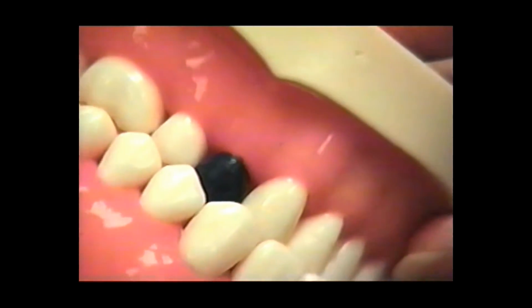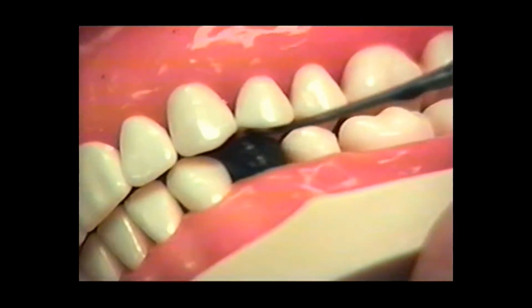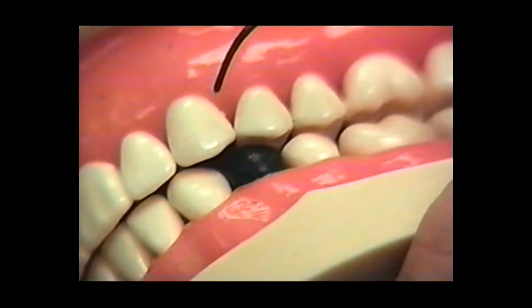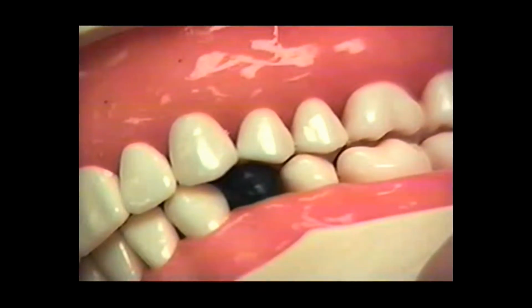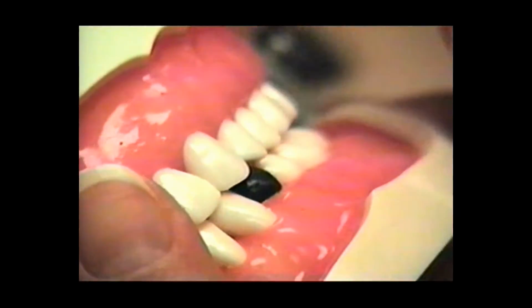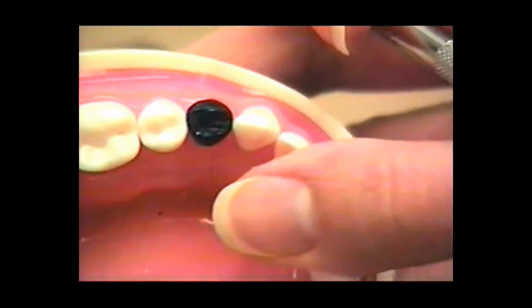Okay? So now what I've done is I've looked at where my cusp tip was as I developed those embrasures and facial contours, and I made sure that it was pretty close to where I need it to be. And if you look, your cusp tips are all in a row, and they're all coming in and meeting the maxillary teeth pretty much at the same spot. And so that's where you want to aim your waxing. And you'll notice that not once have I looked at the contralateral tooth as a guide. I didn't need to, because I've got all these other teeth in here to tell me where I'm at.